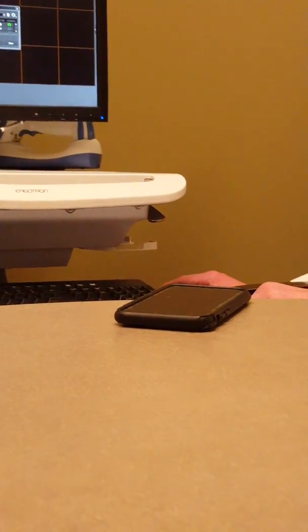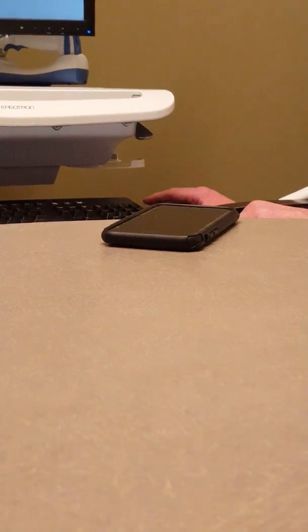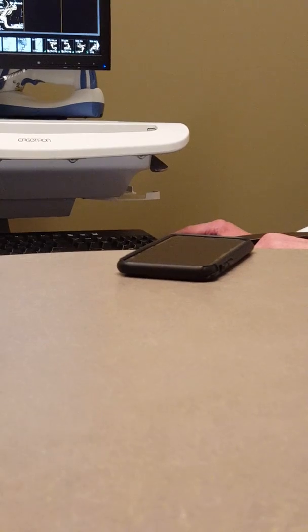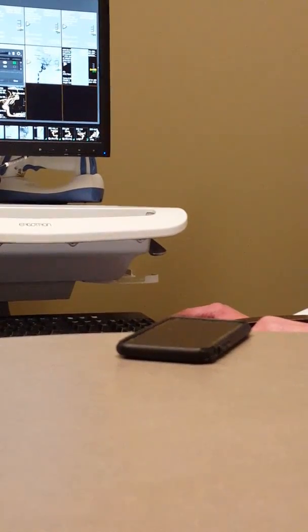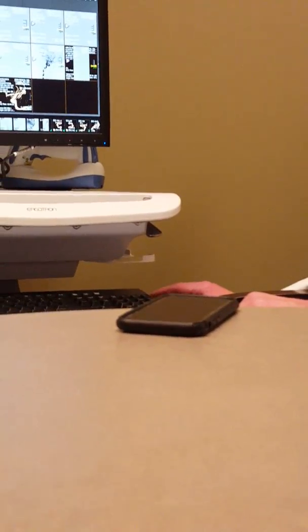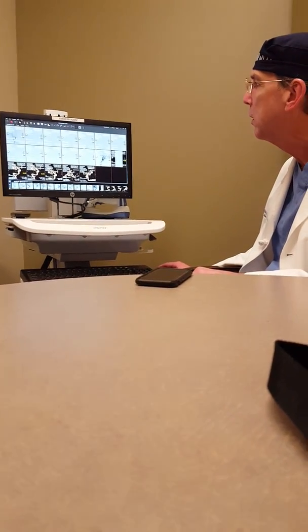Artery called the carotid artery, and so that's what we paid close attention to. Because the angiogram looked like I had an aneurysm, right? And you thought that's what it was. MRA, yeah. Okay. So what we did was a regular angiogram, and these are all your blood vessels.